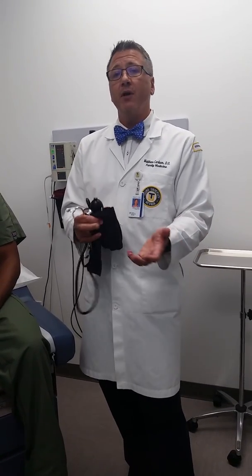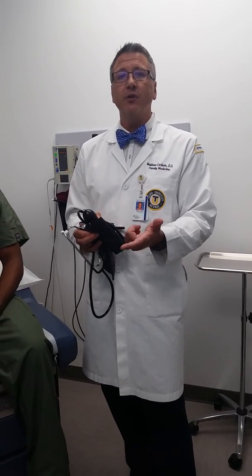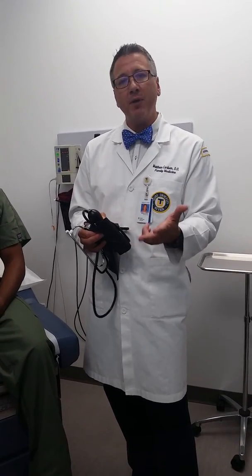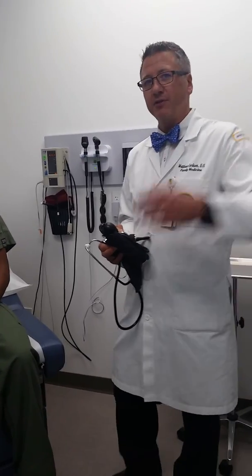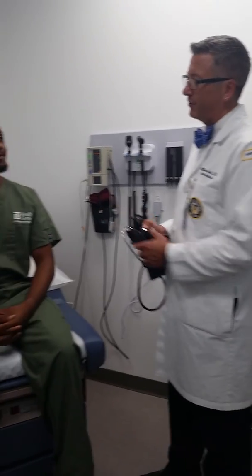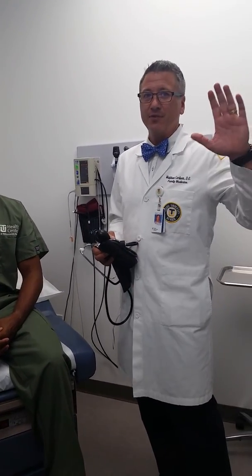The skills we went over today are checking a patient's pulse, assessing and counting their respirations, and taking a palpated and an auscultated blood pressure. Thank you very much to my camera person Chelsea and also our very astute blood pressure model Dushawn. Thanks a lot everybody.